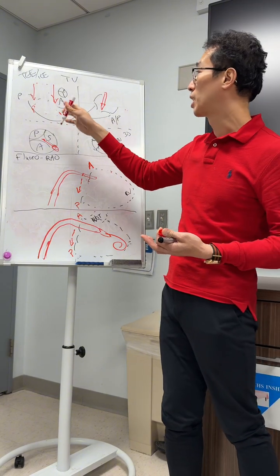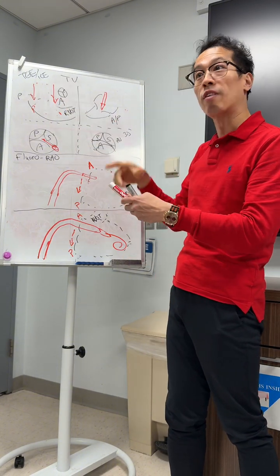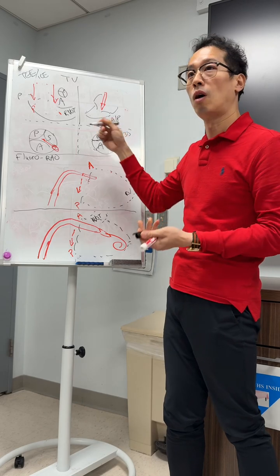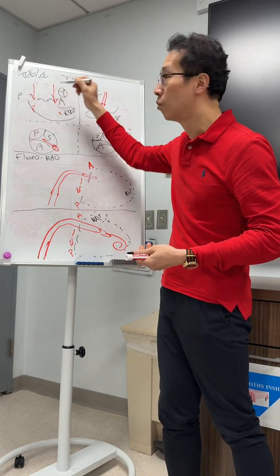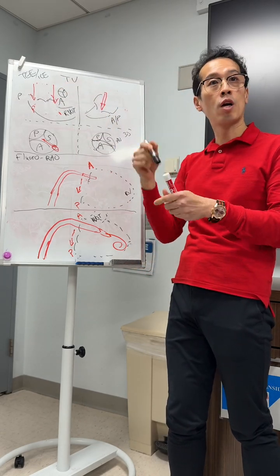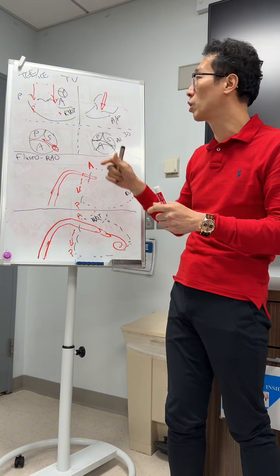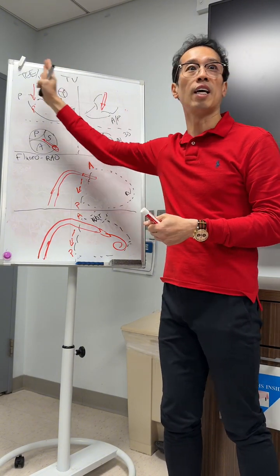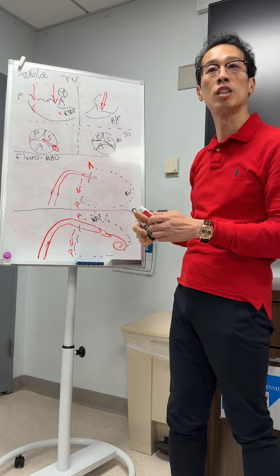And remember, sometimes the imager may be following you. Okay? So it might look good on echo, but fluoro has not moved. So just beware of that mismatch and disconnection, because remember, this MPL, if it's reference to device, it changes, right? Depending on where the device is moving.